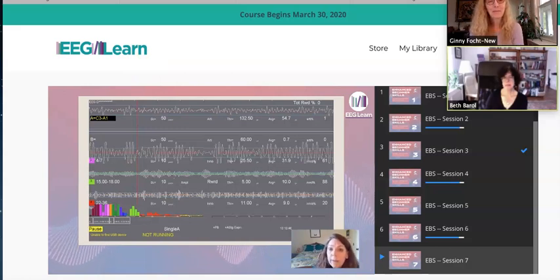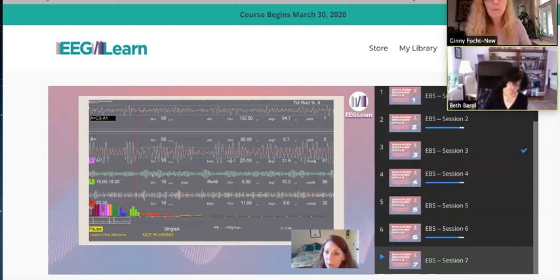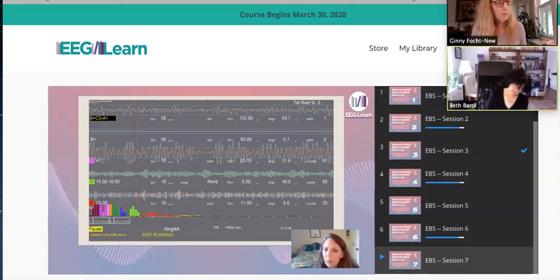What we really want to see happen is this person bringing their slow wave activity down. And we're going to talk about coaching tonight as well. And really, the only way that you can bring your slow wave activity down, the average amplitude of your slow wave activity down, while you're sitting in an office training, is to shift your focus outward, right?